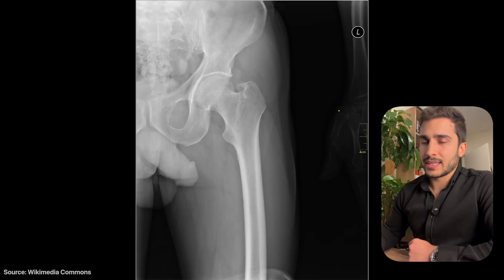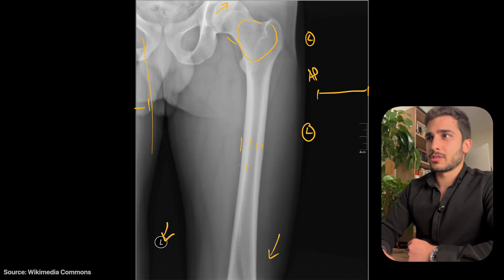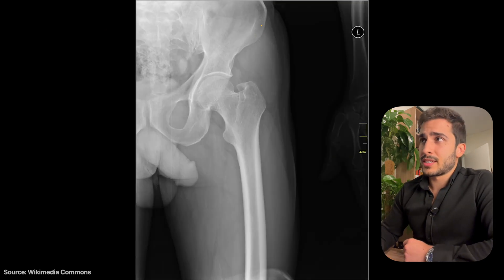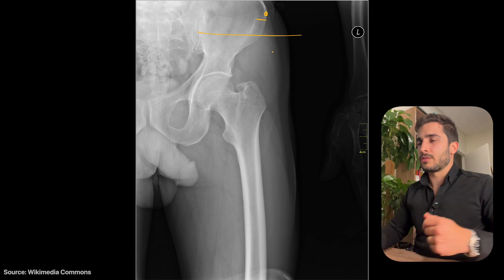Moving to the second case, also a left proximal femur. Compared to the previous one, this one looks a bit different. They've included a little too much at the top — moving towards the iliac crest. The ASIS is roughly there, so you want no higher than that as anything above isn't relevant to the x-ray.